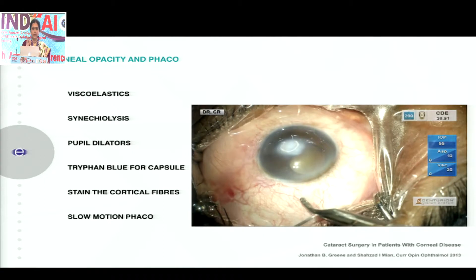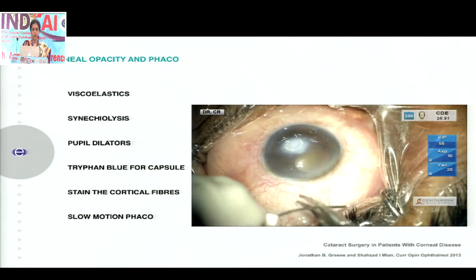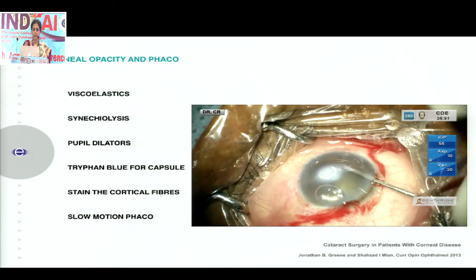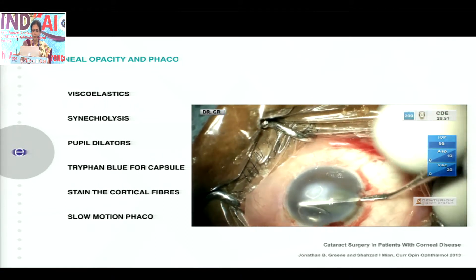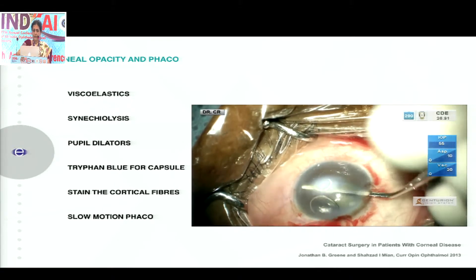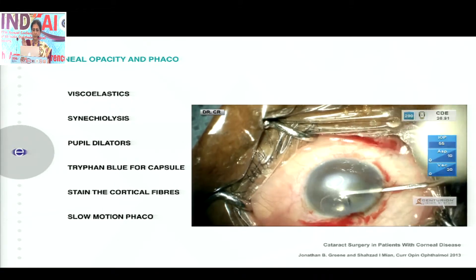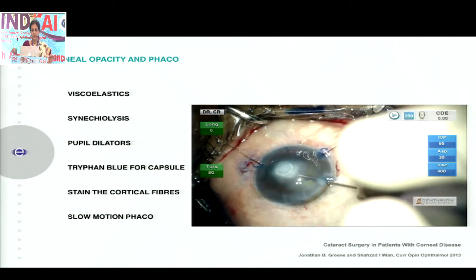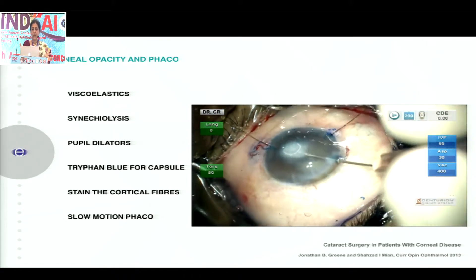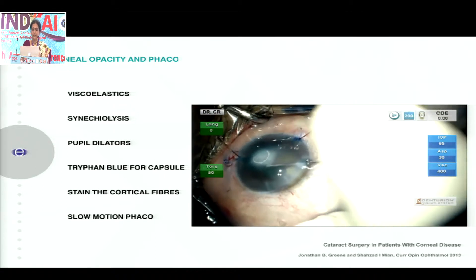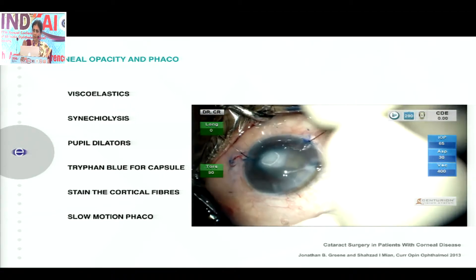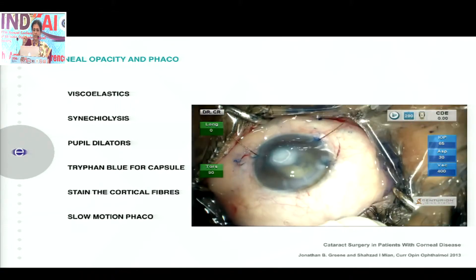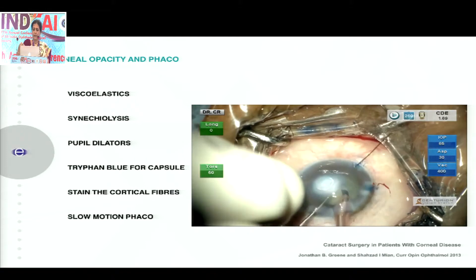Running you through this case: it's a moderate pupil and a significant corneal opacity, but thankfully not lying in the central visual area. First, go back and inject viscoelastic and then do a synechiolysis with a blunt spatula. In this particular scenario, it made sense to place iris retractors to enlarge the pupil, giving greater visibility. You can use a dye — trypan blue — and then go along the pupillary margin. It results in a largely good capsulorhexis.